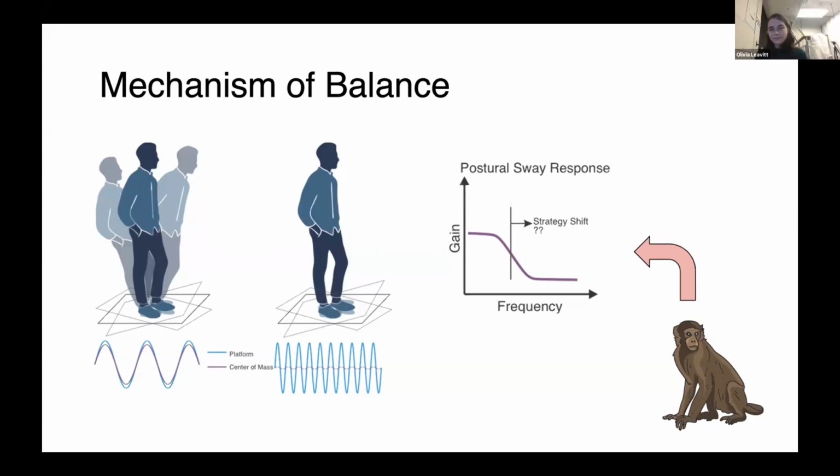So you go ahead. Because the prostheses are generally implanted unilaterally, I would guess that with a perfect prosthesis, a bilateral loss animal with a unilateral prosthesis would perform closer to a unilateral animal. But a unilateral animal would likely not have quite as good posture as a bilaterally native or a normal animal.